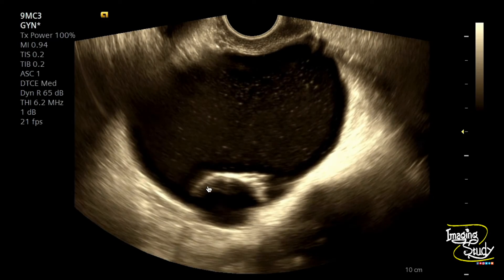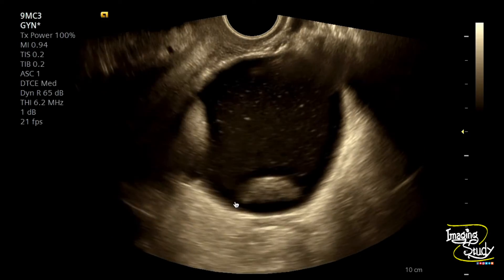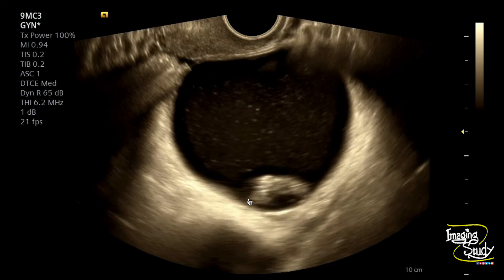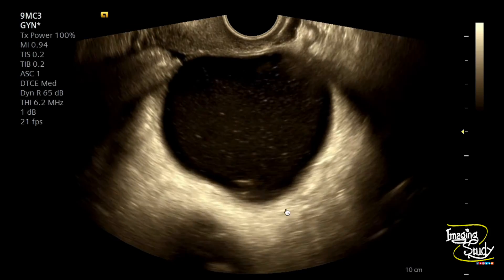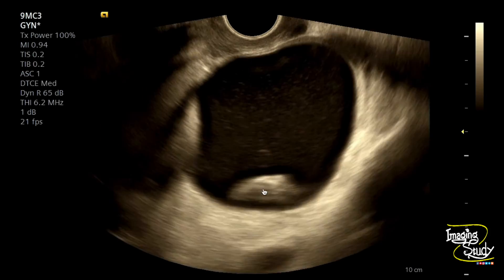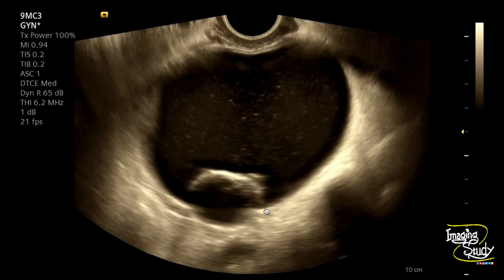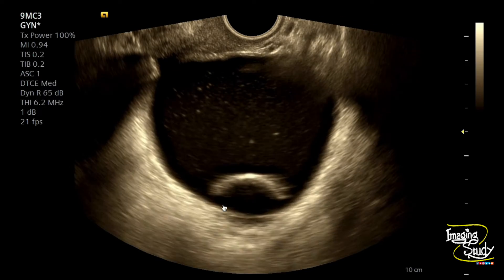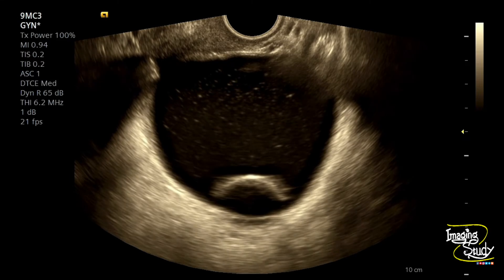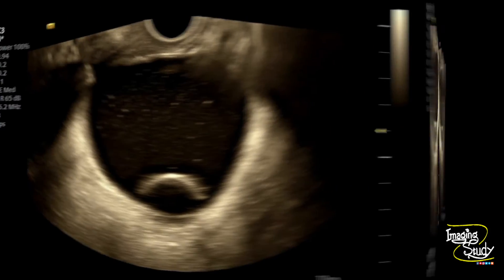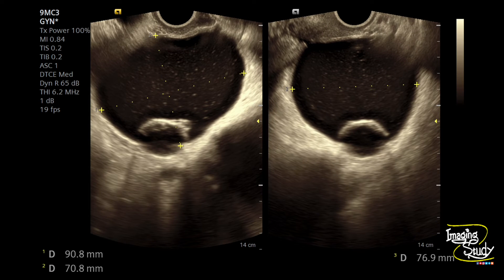You can also see an echogenic component casting a little posterior acoustic shadow, located at the dependent part. Within a dermoid cyst, if you see a calcified area casting posterior acoustic shadow, this is usually the tooth component. Do you know how we can confirm this as a tooth on ultrasound? Here's the measurement — the cystic lesion is around 9 cm by 7 cm.